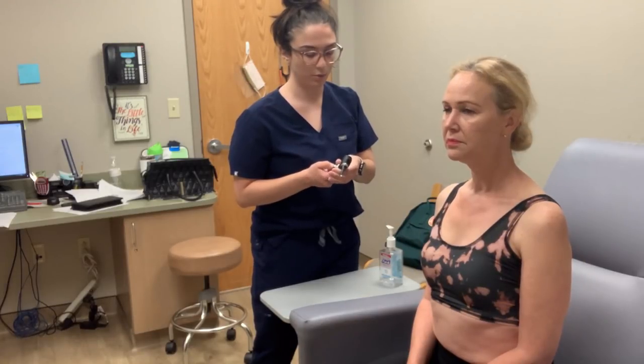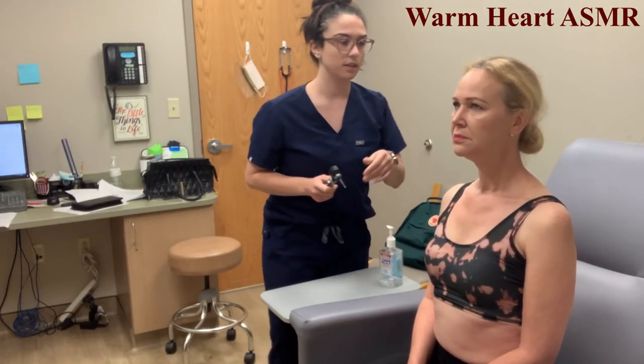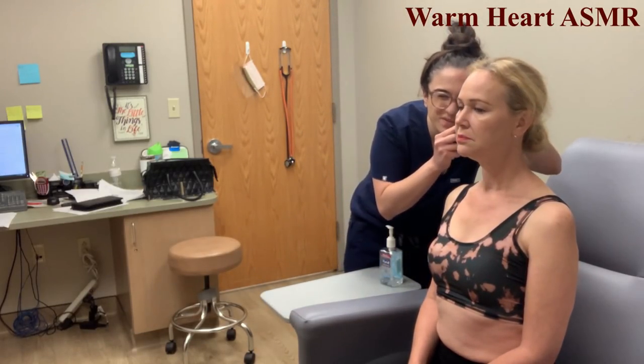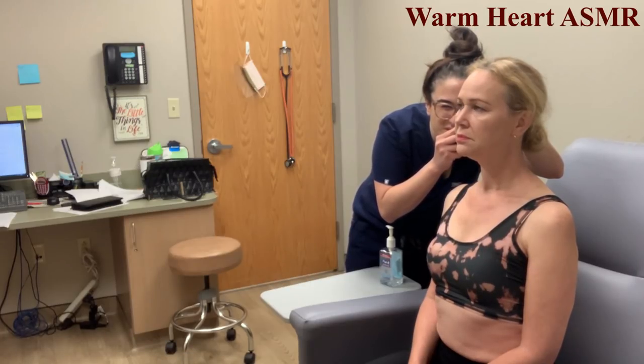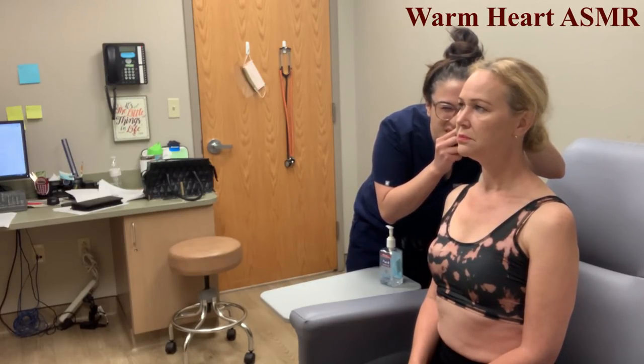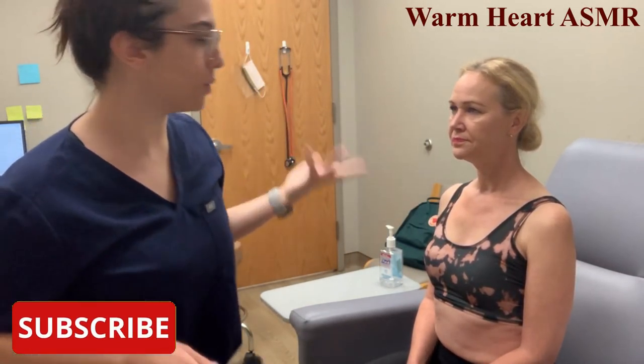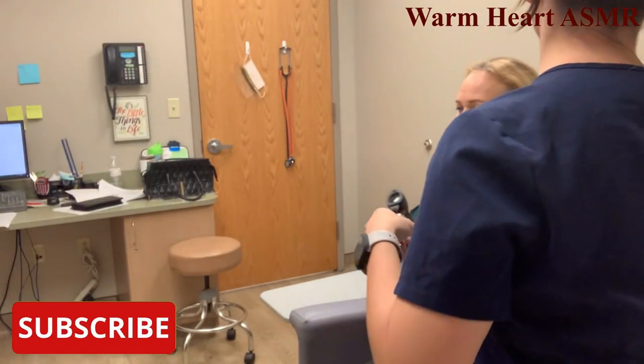I pull back so that I'm able to visualize the inside fully. There's no inflammation, no exudate. The tympanic membrane is pearly white and sort of grayish, so those are normal findings. We're going to check the other ear.